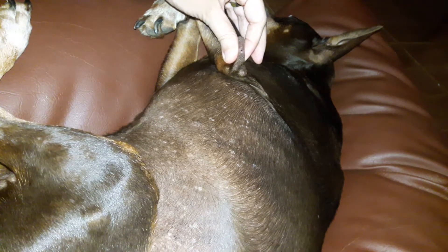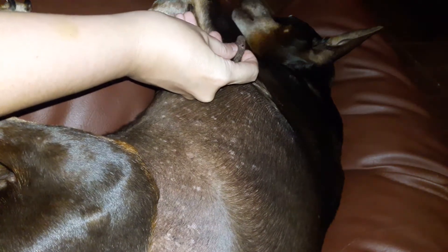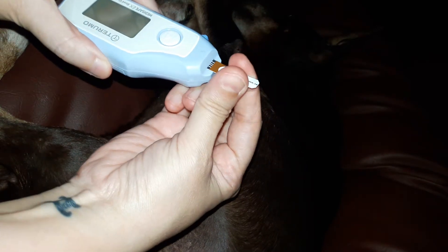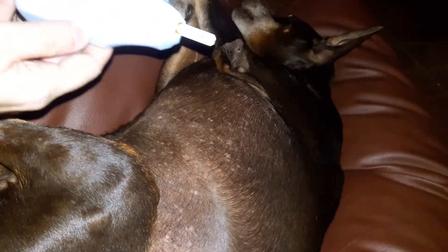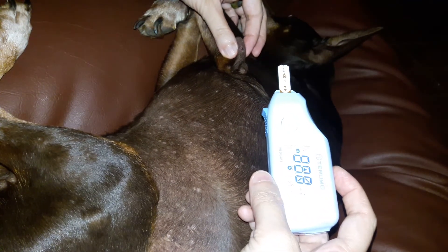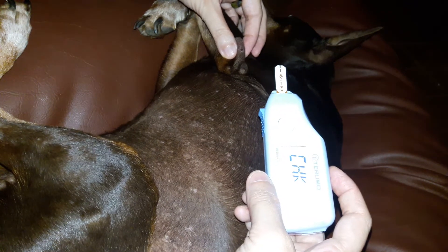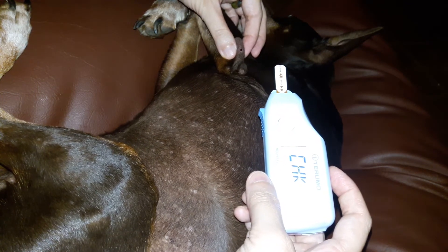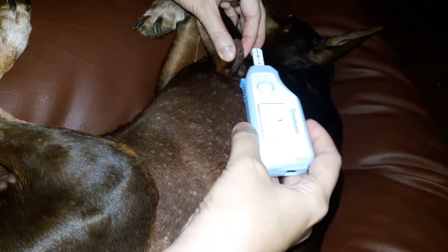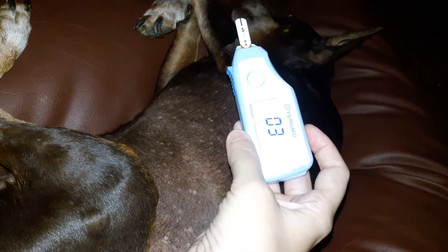The blood's coming up — you can see a tiny little drop, and that's all you need. Just press this in so it activates. Now it's ready for the blood — just touch the tip to the blood, there you go.